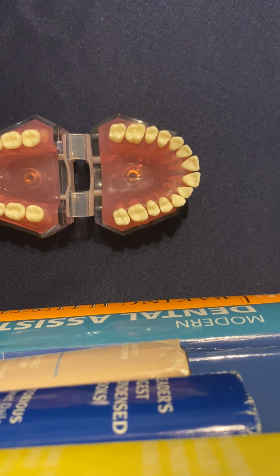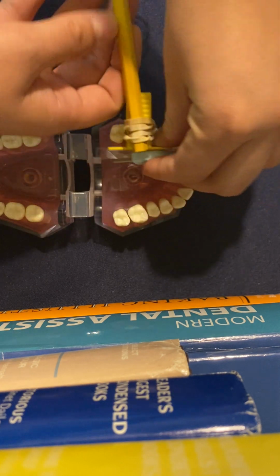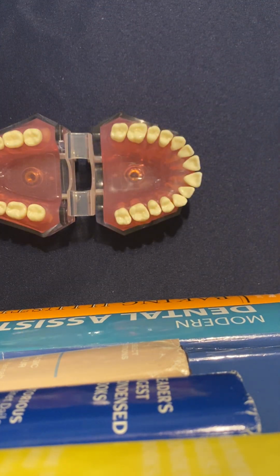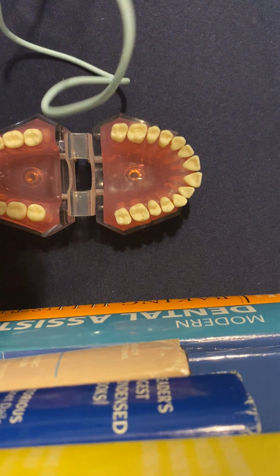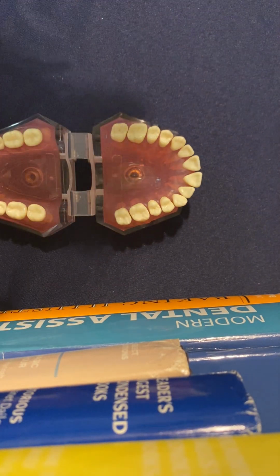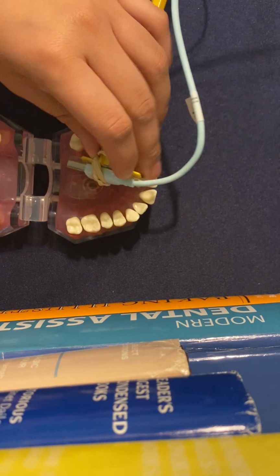And it does matter which way you do it because you don't want the cord to go back down their throat. So this is going to go on the right side, on the maxillary, which does matter. Alright. So number 7, the maxillary right premolar.